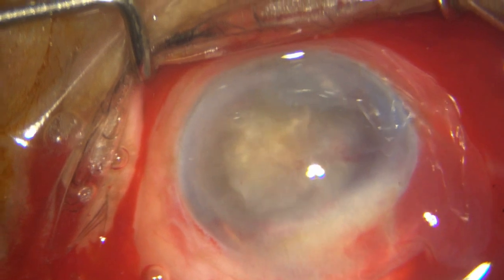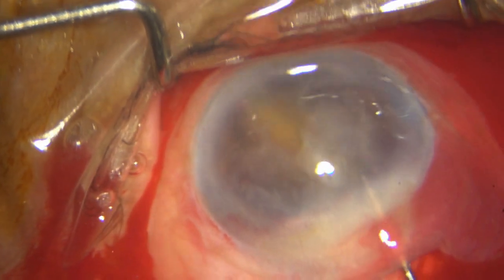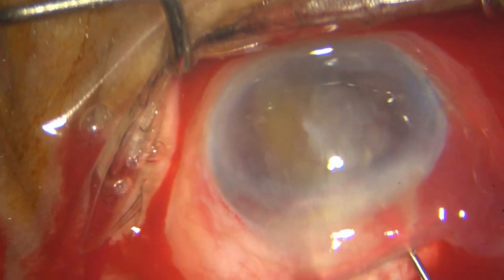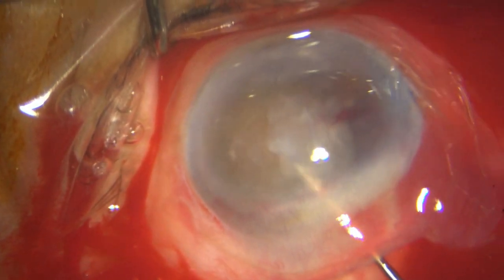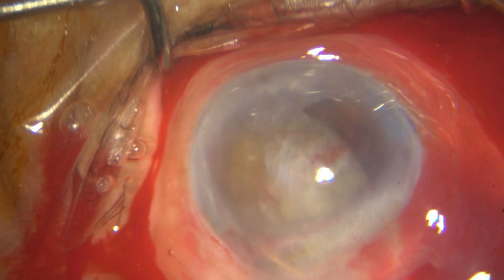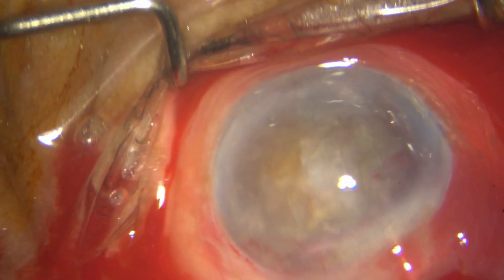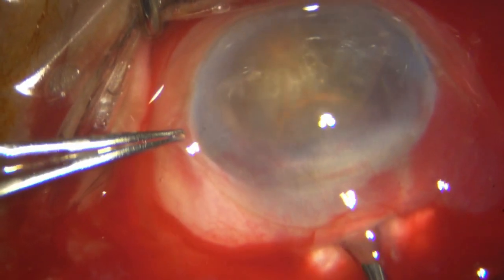You can't take out the nucleus when it is half inside the bag and half outside. It's impossible. You have to get it out, so there's no point in hurrying these steps. I tried to sandwich and tilt it into the AC, partially succeeded, and there it is. I've got it out into the AC. I then use the vectis rather than posterior scleral pressure and bring out the nucleus.